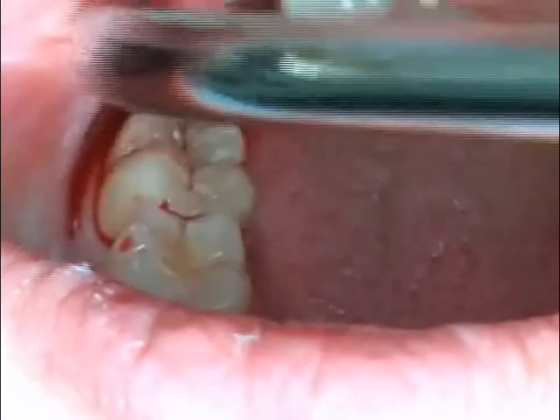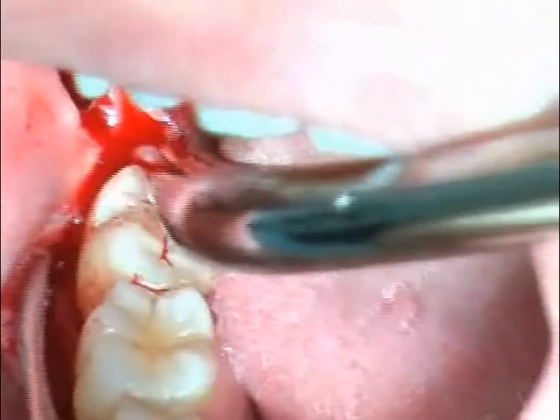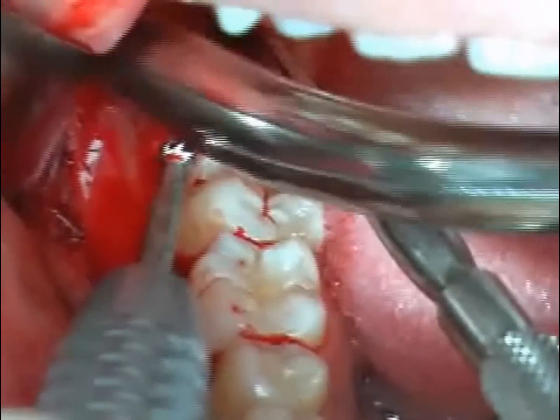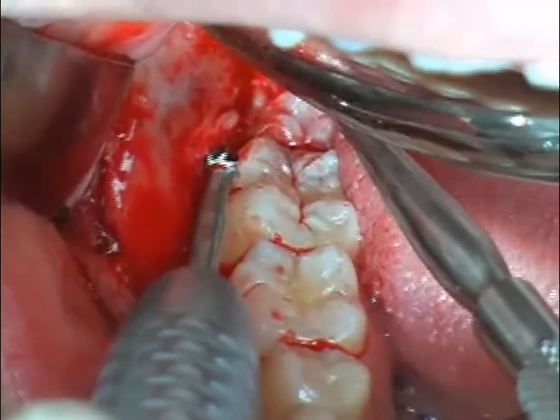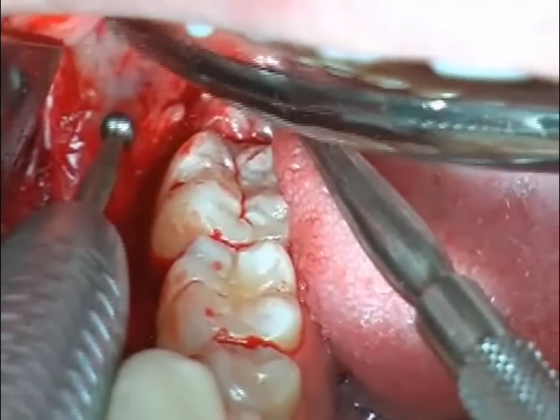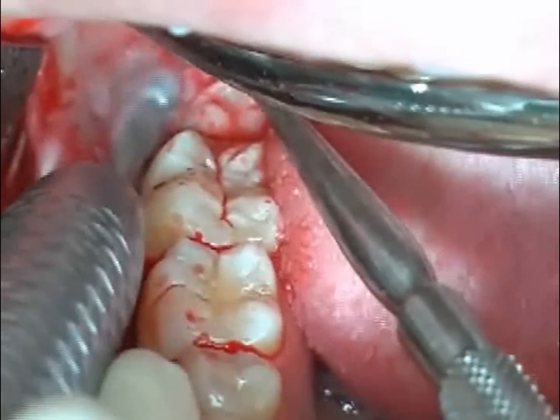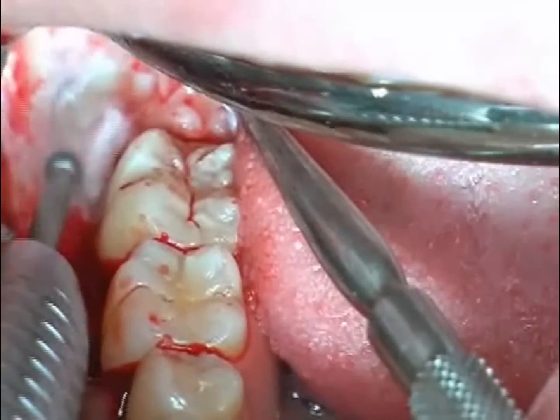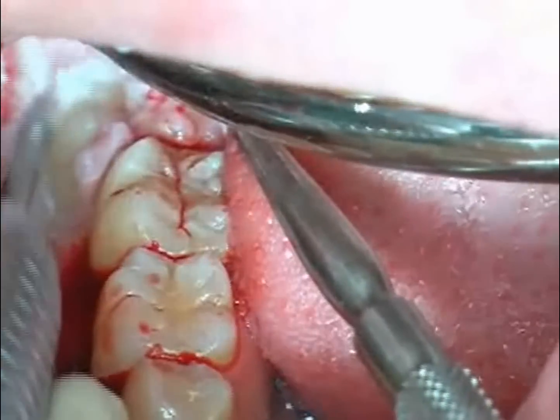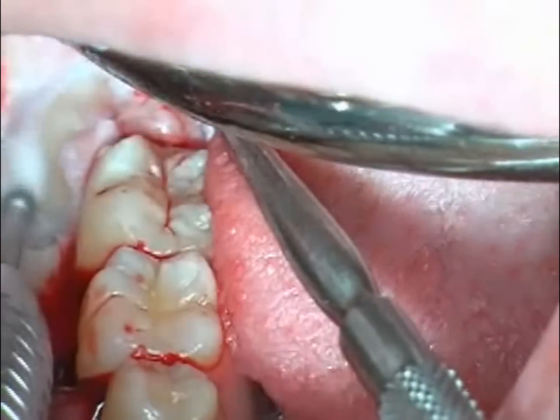You can find out more in the video entitled Gingival Margin Cut. The gums are moved to the side with a retractor, and thus the mucous membrane, including the periosteum, is lifted off the bone. A wide retractor is placed underneath the periosteum in order to protect the other soft parts, such as the lingual nerve.